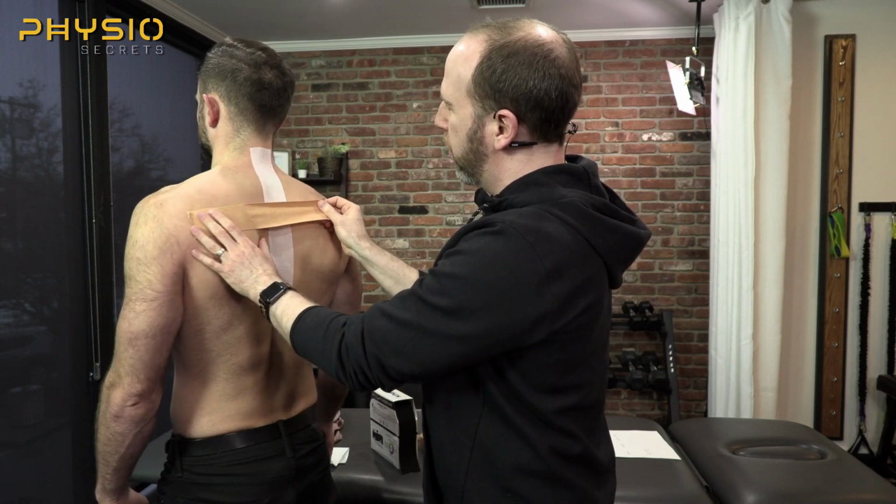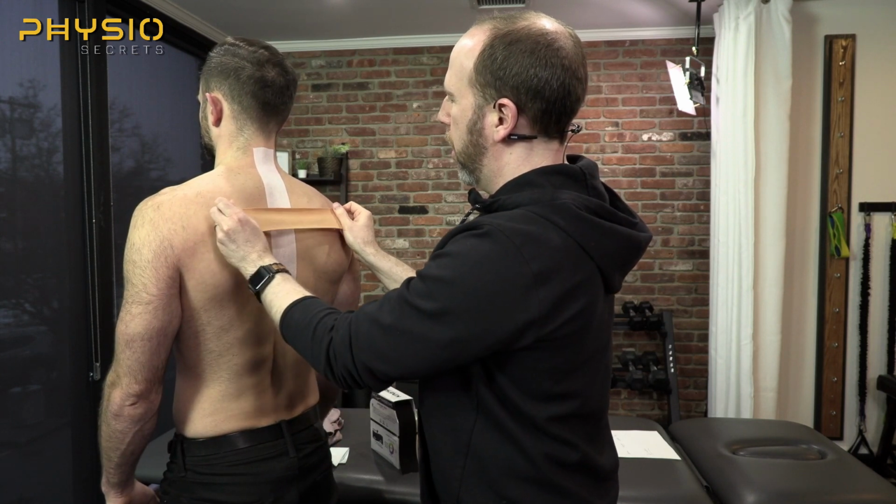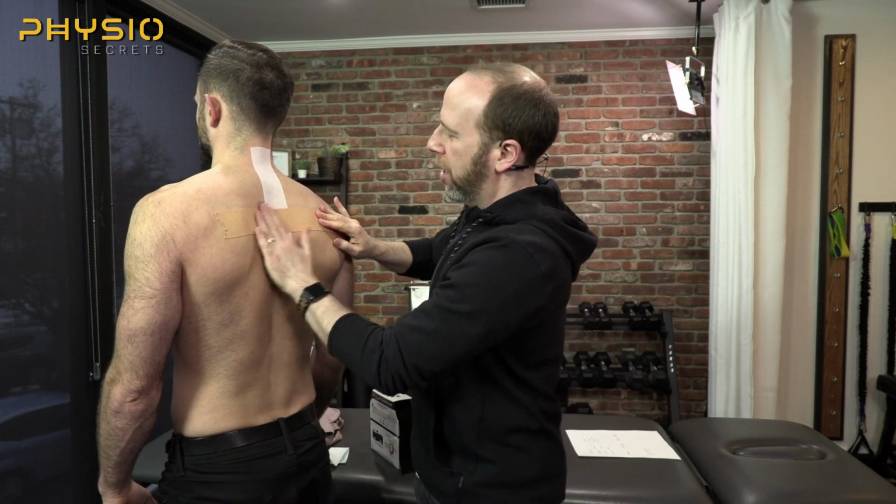Go ahead and relax your shoulder blades forward. And let's get this right here. Let's apply too little stretch.